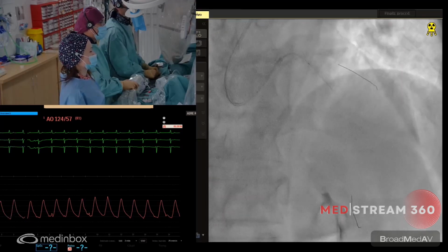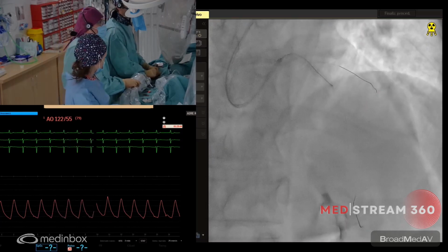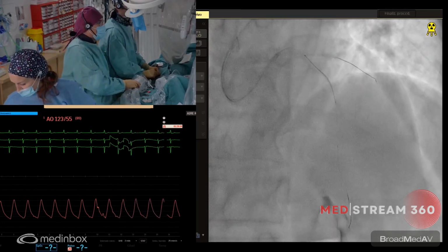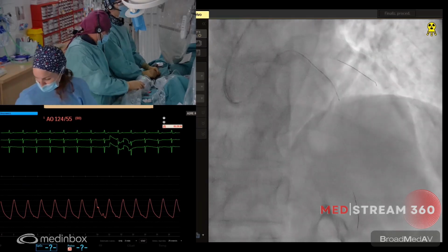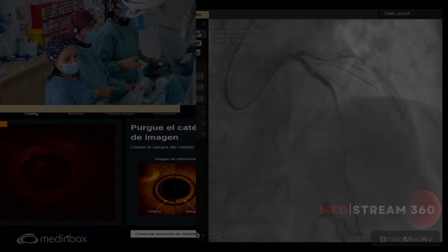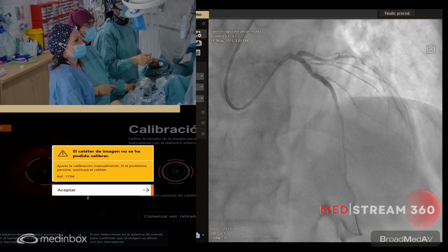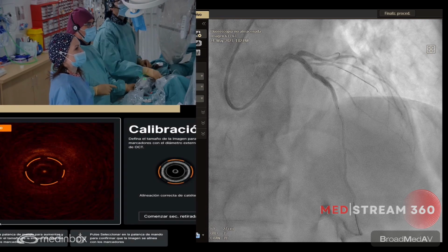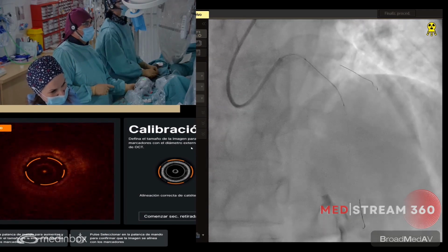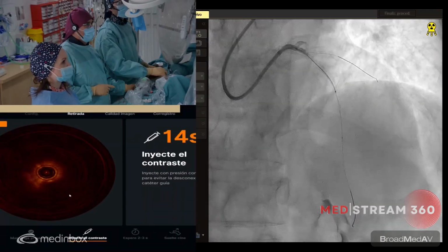You know, that is a usual thing with OCT that after the first or second use, the catheter is not so pushable, but slowly you can open the Y connector, and I think I'm there. Okay, that's enough. Let's check if the guiding catheter is inside the vessel. Okay, I think I'm there. Let's work it here. I don't know if there is some issue with the catheter. Okay, the alignment is good. So, go. Injector. Yeah.